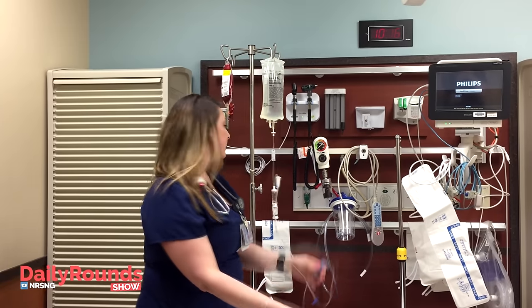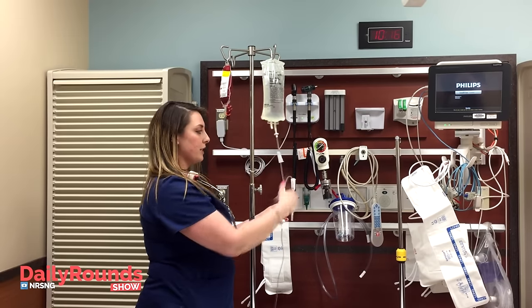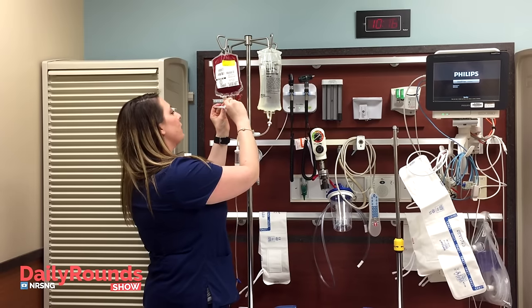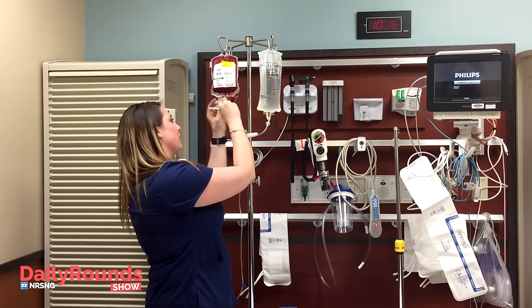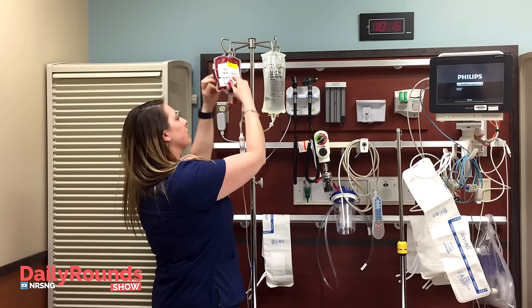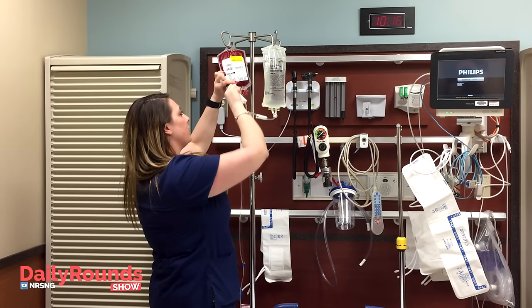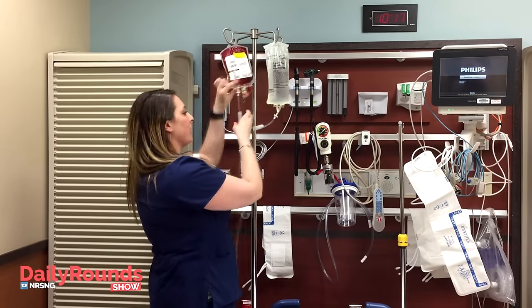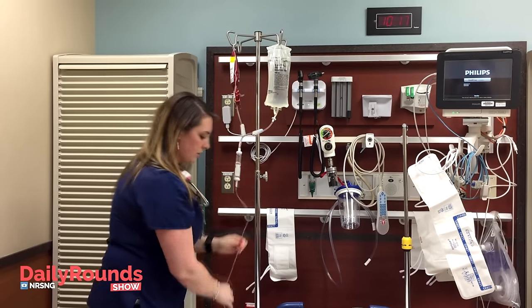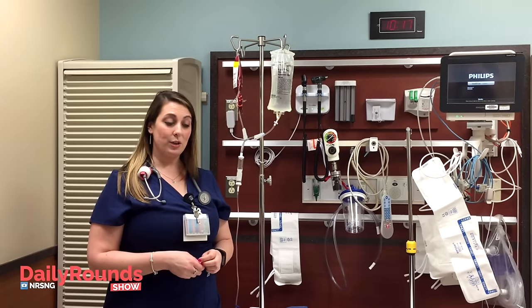You want to close off your clamp — this is the most important part. You close off this clamp so that your blood, when you spike it, doesn't end up going back up into your bag. Then you open up your blood and make sure you spike it in with all the clamps closed. Then open this clamp first.